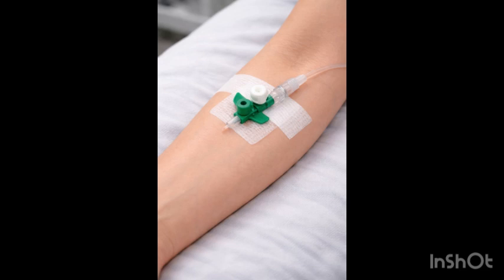You can differentiate whether it's a vein or an artery. The most important thing to look for is whether there is any pulsatility. What is the location? At the medial cubital fossa, you can accidentally get the brachial artery, and also at the wrist there can be an aberrant radial artery. Arteries are much deeper, and the blood flow will be bright blood with high pressure, pulsatile flow.